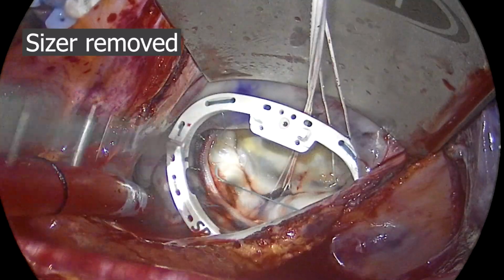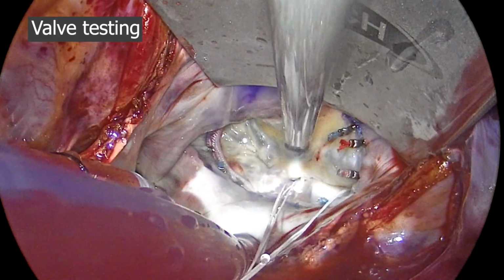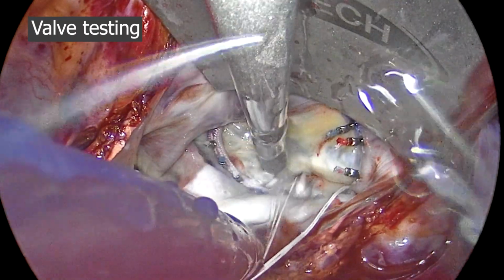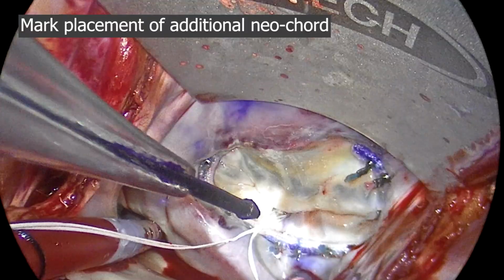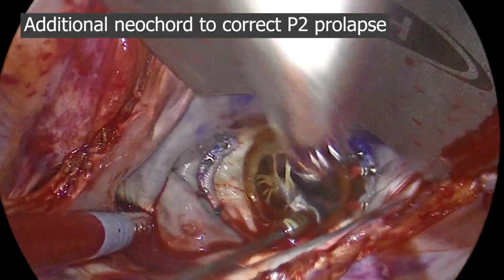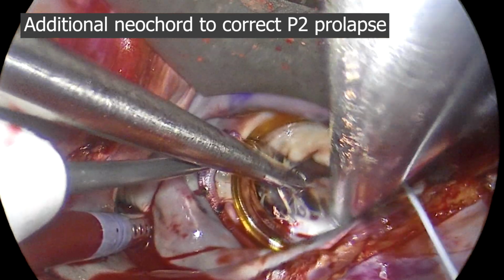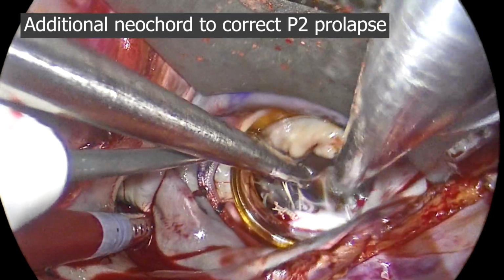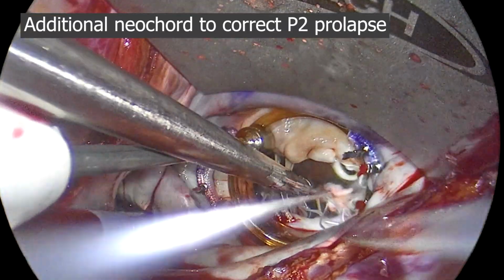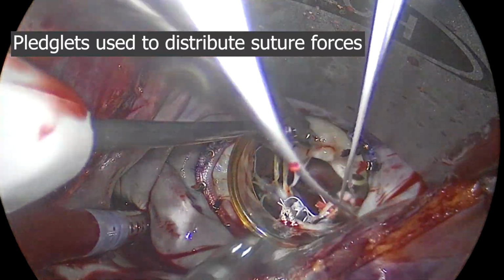After securing the band, the valve is retested, still demonstrating the residual jet from P1, P2. We mark this prolapsing segment in preparation for an additional neocord. An additional pleated neocord is then placed at the medial papillary muscle. We utilize pledgets to minimize trauma to the muscle.